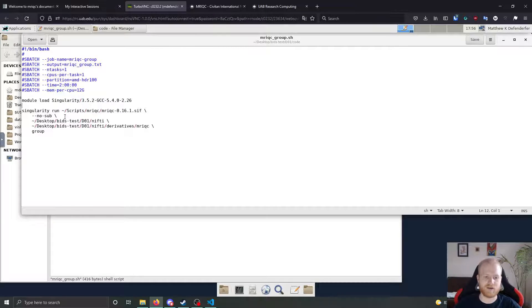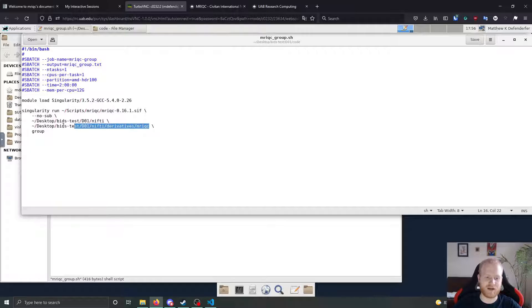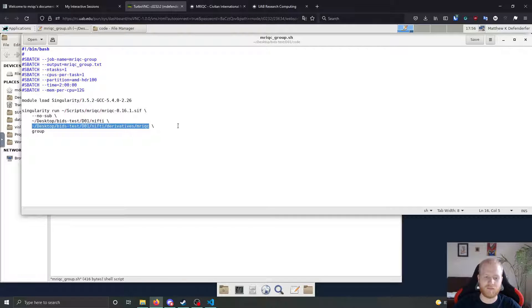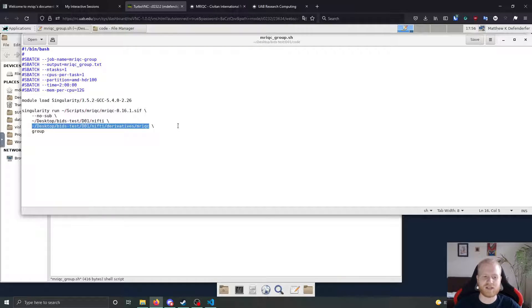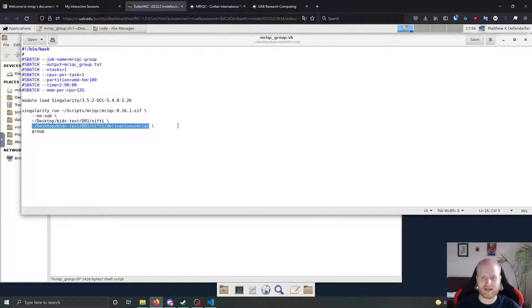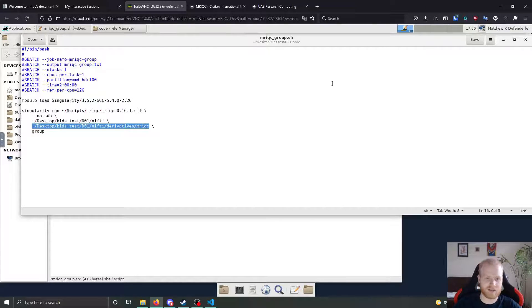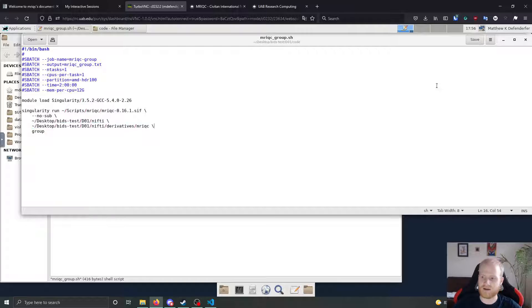What it's going to do is it's going to go to this output directory that you've named with all of the participant level outputs. And it's just going to grab all of those outputs that it sees and aggregate them together. So you don't need to give it a list of participants or anything like that.